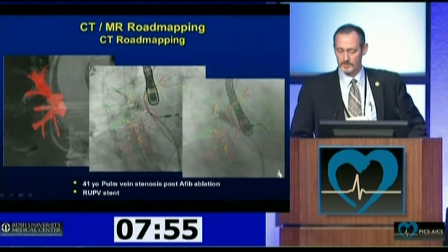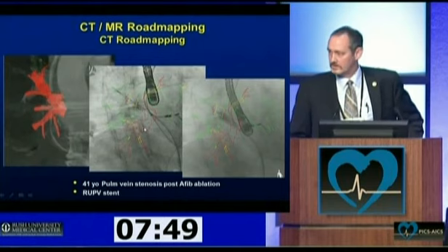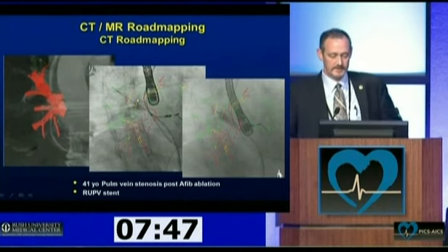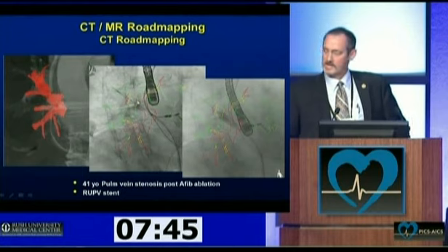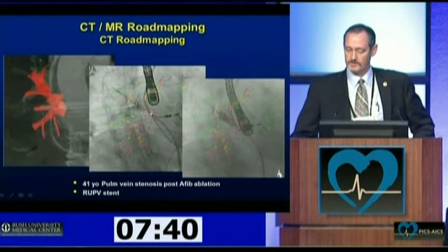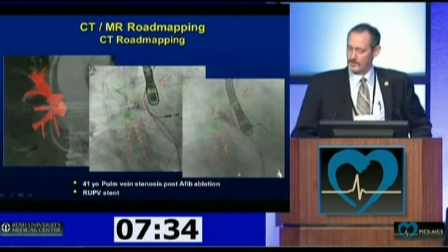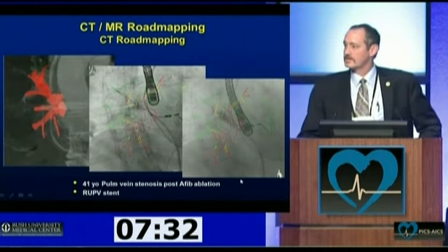This is the right upper pulmonary vein after transseptal approach and catheter wire position. Again, it gets a little confusing with her pacemaker leads and TEE probe. And again, here the airway is outlined in green, but where it crosses the vasculature, it turns yellow. So it's a little complicated, but the area of interest was right here where that right pulmonary vein stenosis is. Hopefully that shows up well enough for everybody. Again, the frame on the far right shows stent delivery across the area.